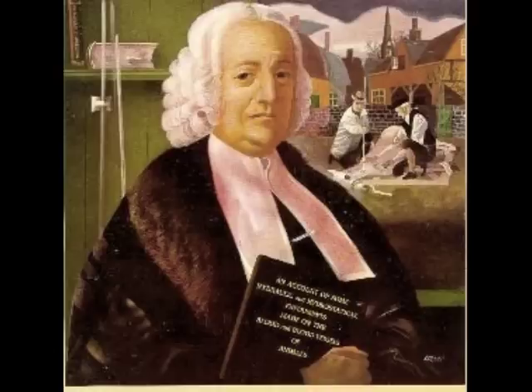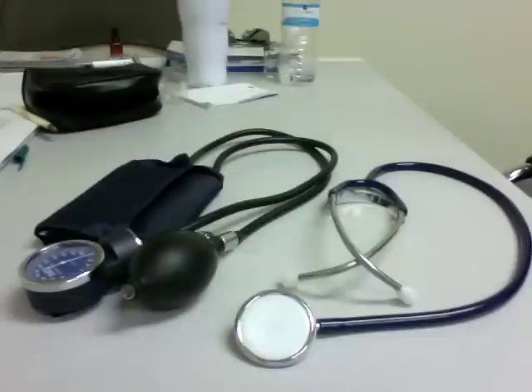From the original discovery of blood pressure by Stephen Hales in 1733 to modern advancements in the measure, the great importance of blood pressure to clinical diagnosis has remained constant. As it is used today, the sphygmomanometer is comprised of three parts: the occluding cuff, the manometer, and the stethoscope. The cuff consists of an expandable rubber bladder contained in a non-distensible cuff. Attached to this cuff is an inflation bulb, which contains a valve in order for the tester to release or contain pressure in the cuff. The stethoscope, consisting of a head, tubing, and earpieces, is placed over the occluded artery to maximally amplify the Korotkoff sounds.